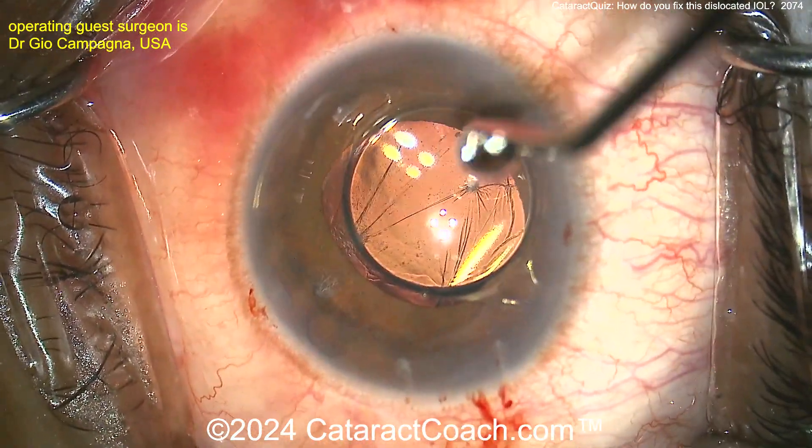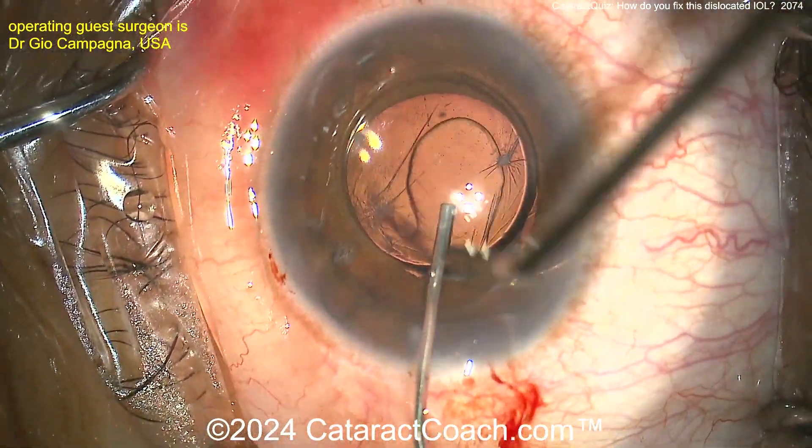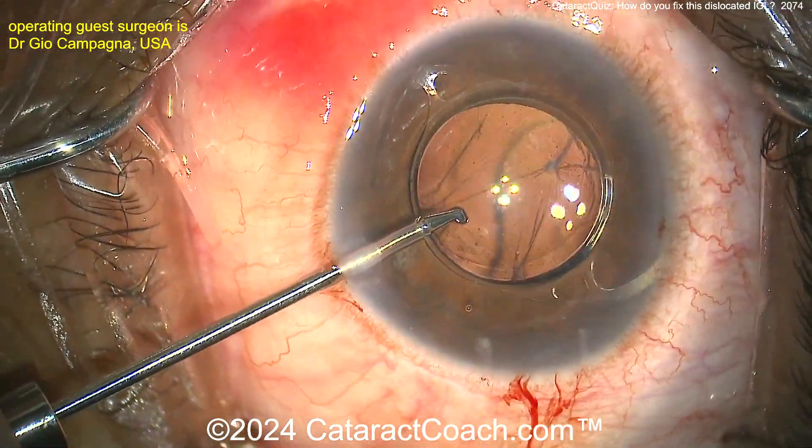Keep in mind that there is some reasonable capsular support there. What's the least invasive thing? Do you just rip out the lens, rip out the capsule, and just suture to the sclera or do a Yamane? Maybe there's an alternative method here.